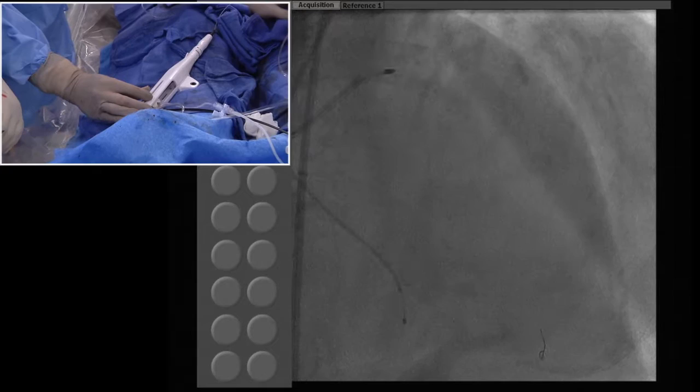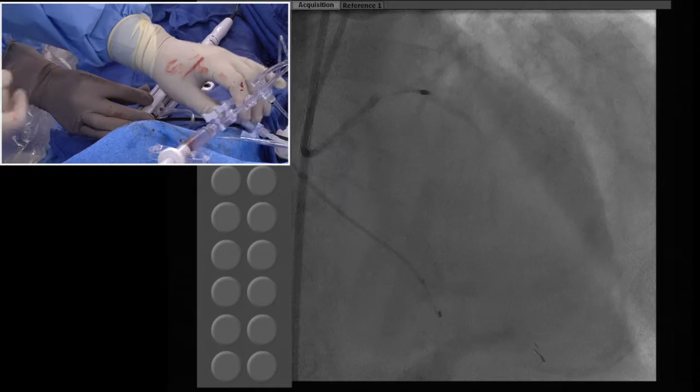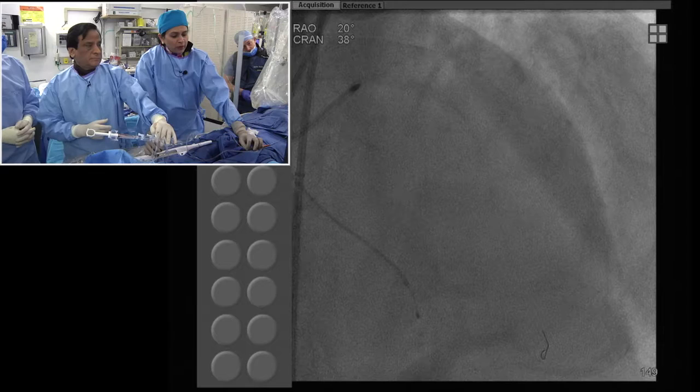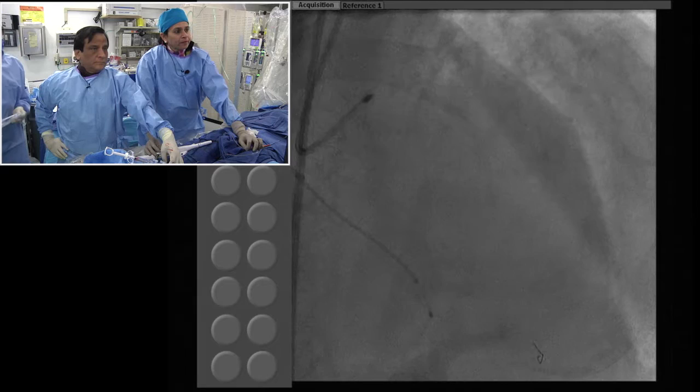This is a 1.75 burr, 7 French VL guide, VL 3.0. We initially went with VL 3.5 — it was too big. Once you have a long sheath, most of the tortuosity is taken care of and you need a shorter guide. For the left main we probably need a bigger burr, which we don't want to do. So the plan is to go with the 1.75 and we are already ready with the cutting balloon. We'll do a cutting balloon of the distal left main. The patient is tolerating this with no problem.